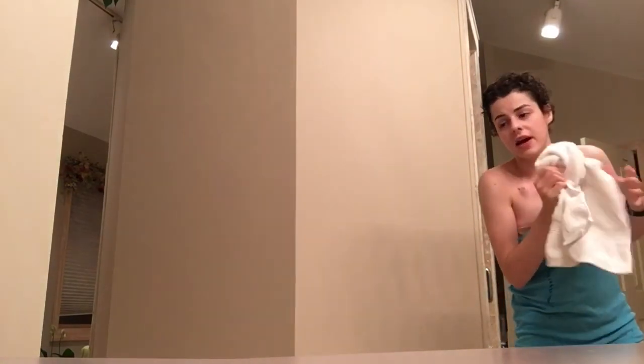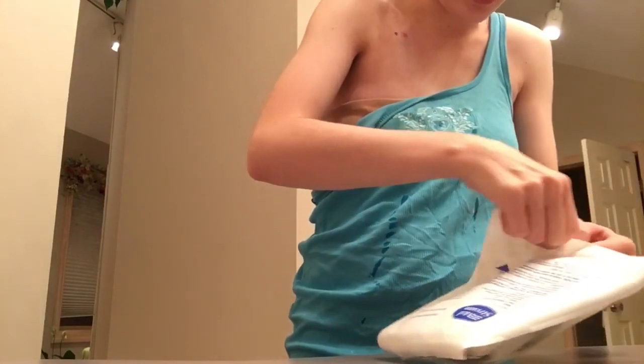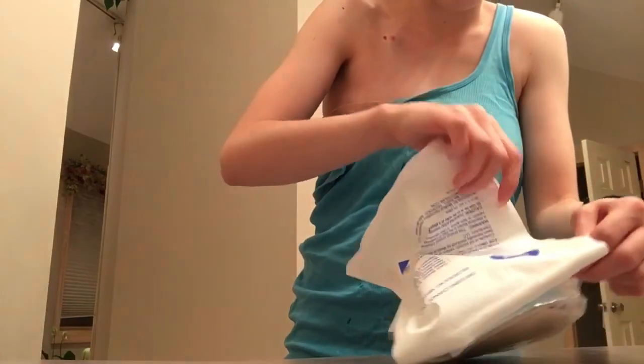Since I don't have anyone taking this video for me, it's not the best for being able to see things, but the things I can, I will hold up in front. The things on the counter that can't be seen, it is what it is. So I'm going to start off getting my dressing kit, and I'm bringing it over here because this counter space that you cannot see is all free. And I'm opening it up and not touching anything but the very, very outside, just as usual.